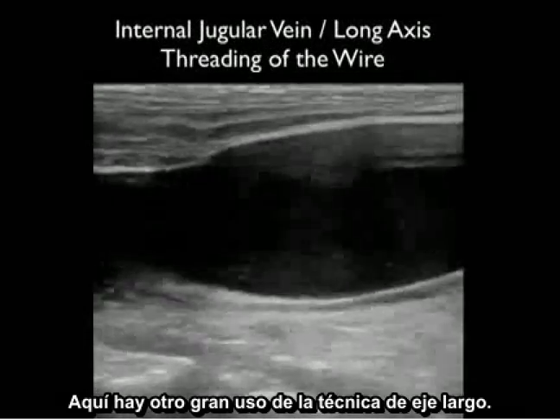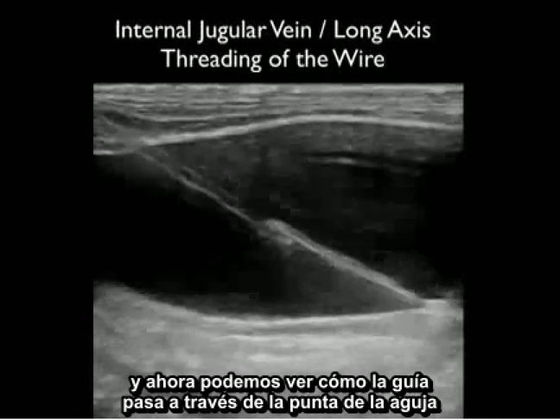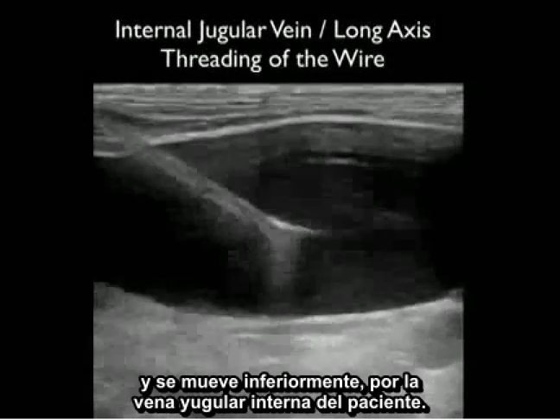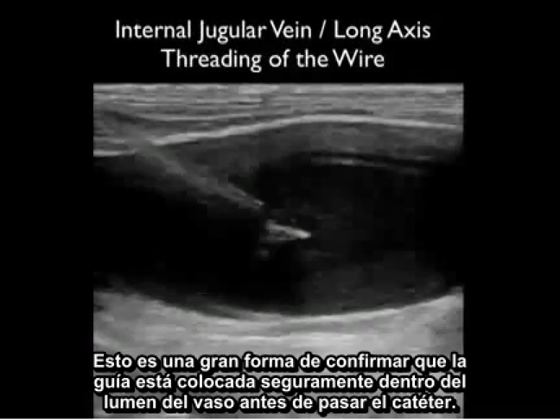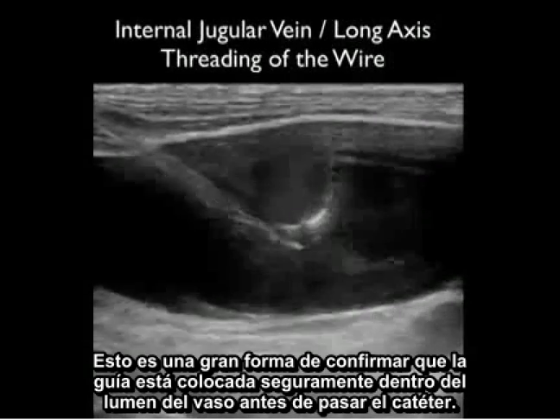Here's another great use of the long axis technique. We're confirming that the needle tip is located within the vessel lumen, and now we can watch as the guide wire passes through the tip of the needle and moves down inferiorly down the patient's internal jugular vein. This is a great way of confirming that the guide wire is safely parked within the lumen of the vessel before threading the catheter.